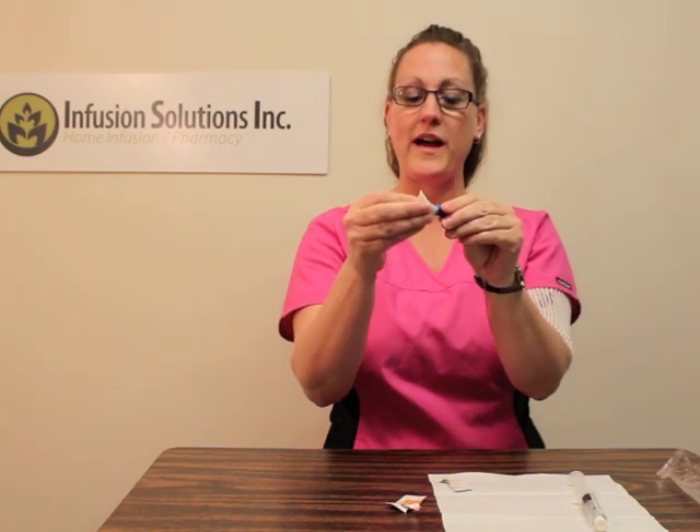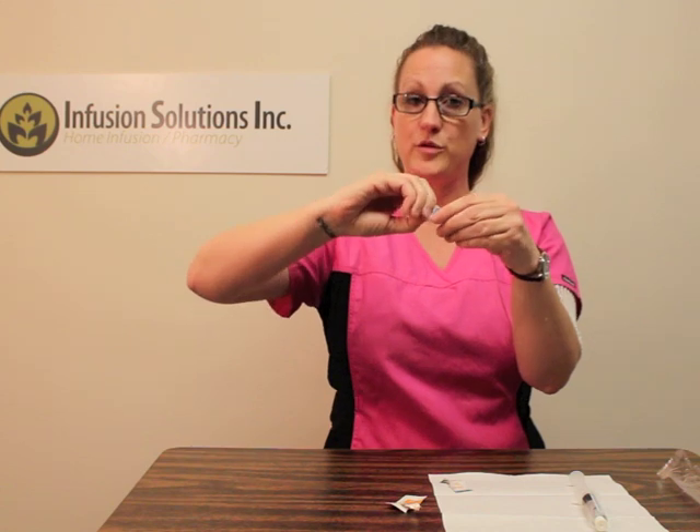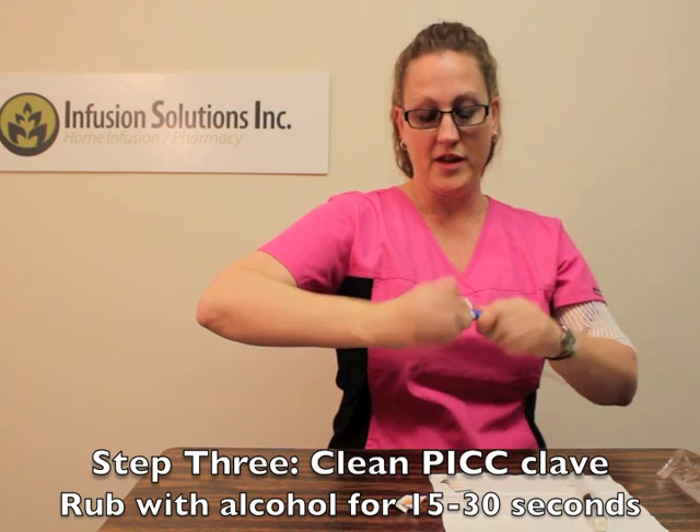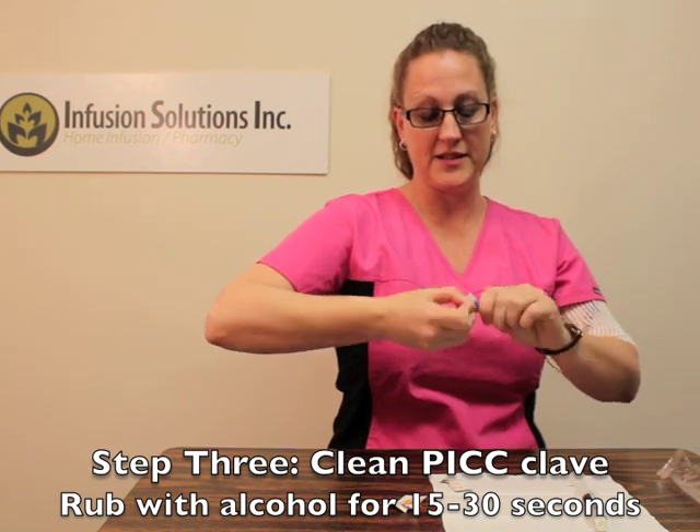Wrap your alcohol pad around the end of the clave, squeeze it, give it some good friction, and clean it by rubbing it back and forth for 15 to 30 seconds. Feel free to sing a little ditty while you're doing this — I enjoy this song.